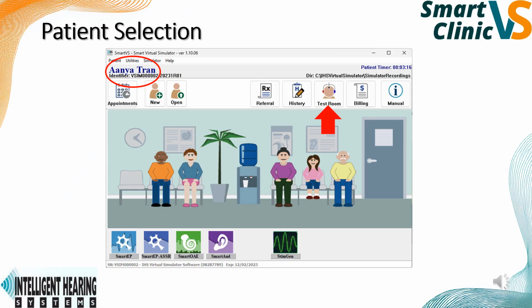The first step is to select your patient. This can be done by going to the Appointments button and choosing your patient. In this case, we will be using Anya Tran. After we've selected our patient, click on the test room.